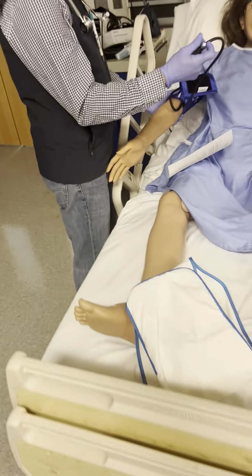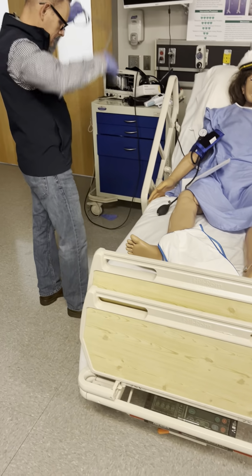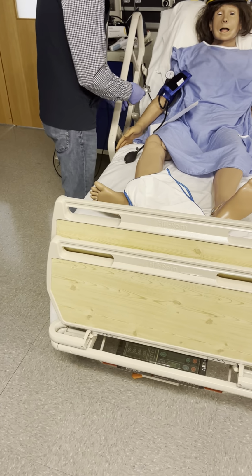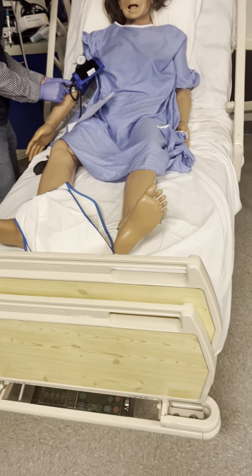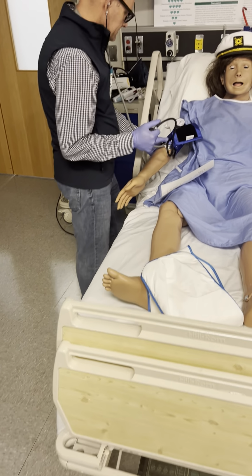Make sure my valve is closed. And then I'm gonna take my stethoscope, put it on, make sure it's open to the right end. I'm gonna place it just under her cuff. There we go. Now I'm gonna pump this up to 180.